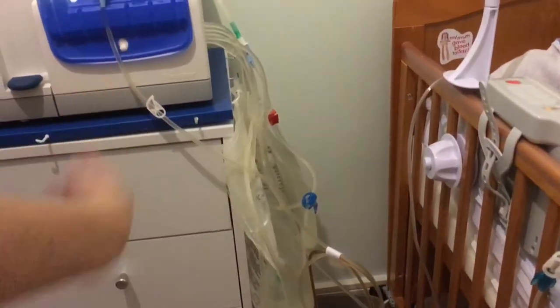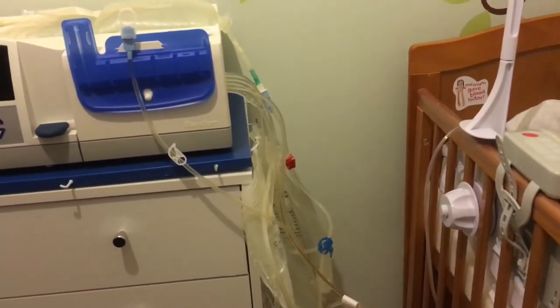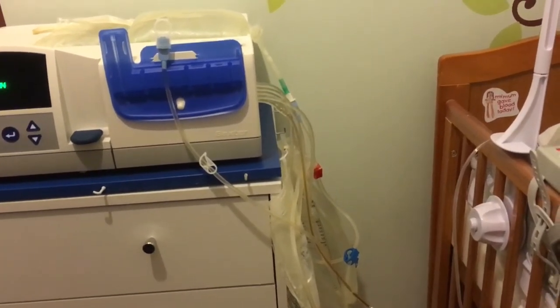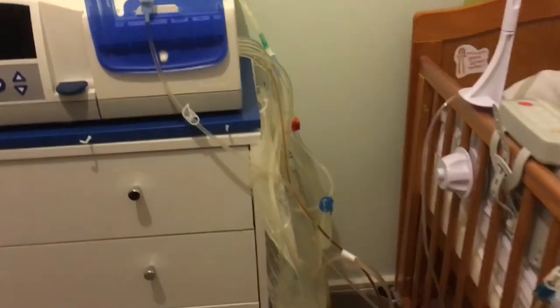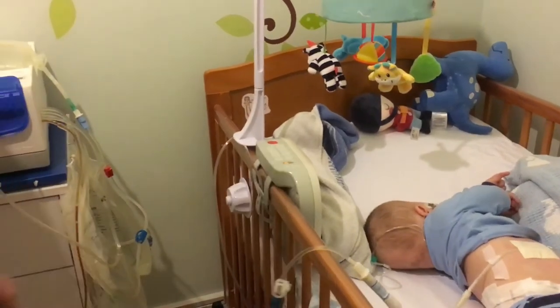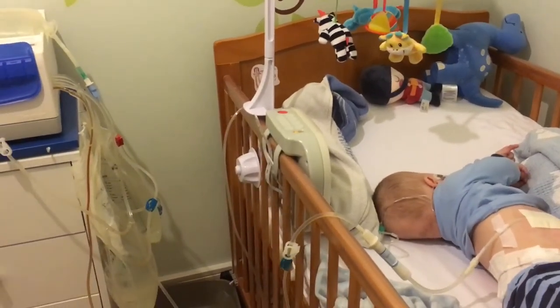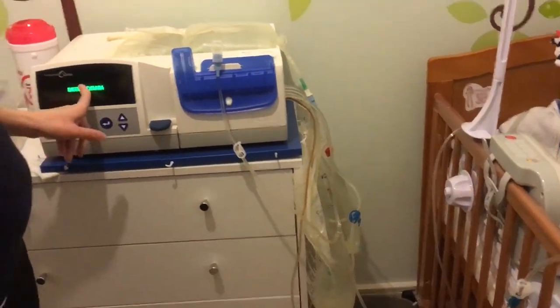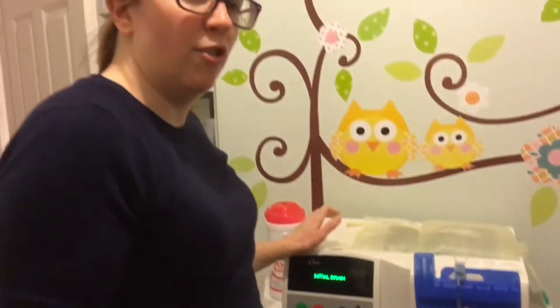It goes all the way through the tube and off into the machine in a minute. Sometimes it does it nice and quickly, other times it's a bit of a struggle like today. So the initial drain means — as I said earlier — Ethan has a last bag filled, so he has a tummy full of 200 mils all day long. So this is now just trying to get out as much of that 200 mils as it can before it starts the procedure.